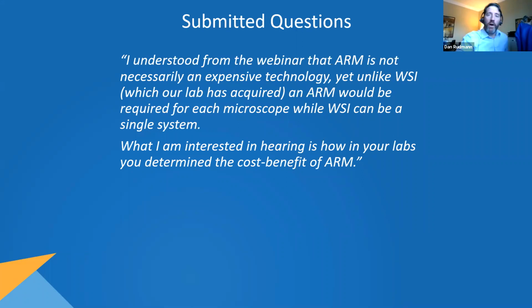Now, for my company, like Charles River, we have over 150 pathologists across the globe, multiple sites. So clearly for us, putting a single unit on all 160 microscopes, I mean, we could do it, but we could also take advantage of a network of scanners that can interact together.